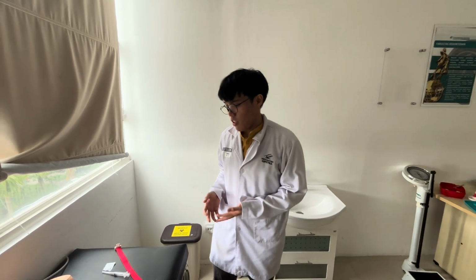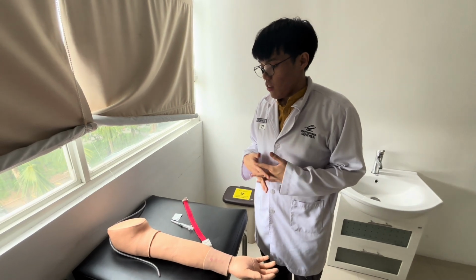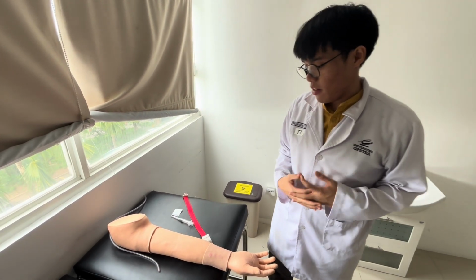Morning, my name is Sebastian Saelan. So today we'll be conducting an injection of intravenous, intramuscular, and also subcutaneous.